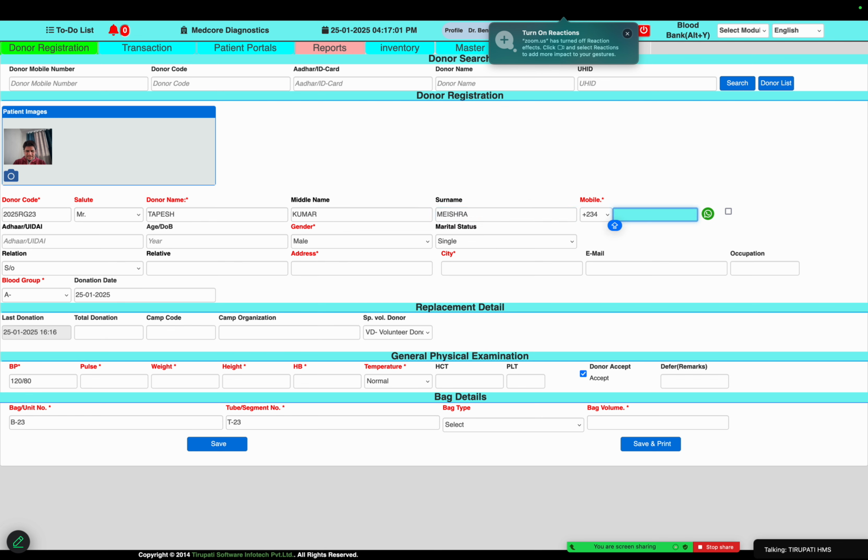Mishra. Patient age, we can put here any mobile number that is needed, and here the patient age, what is the year of the patient, and here if any attendant relative names of the patient, we can put here. And here the patient address, like Cameroon or city like that. Osaka, Odeda, Nigeria. Okay, so nice, Lagos city name.